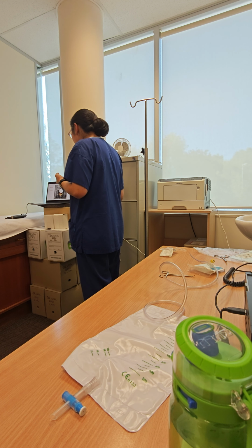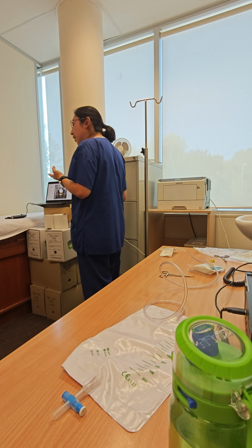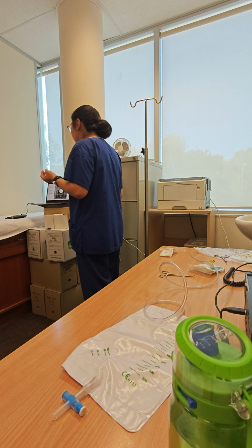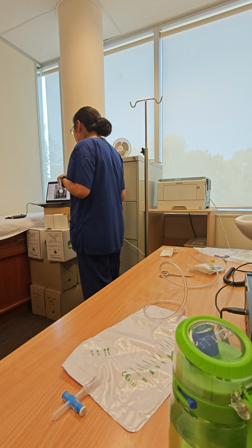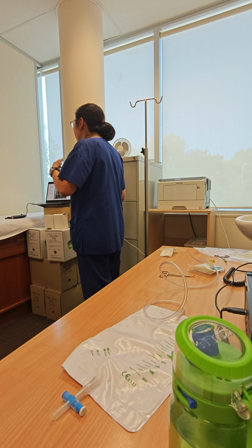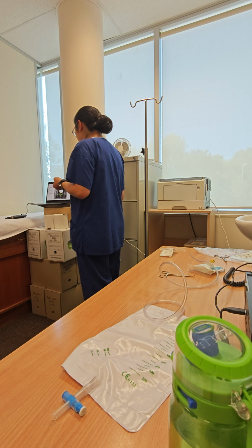That's the two weeks later. That's the yellow part, it's a leakage. We can see there's still a leakage there, but it's shrinking. How about another two weeks later? That's the green part. We can see there's still a little bit of leak under the bladder, but it's much smaller. That means maybe the leak is healing. All right.